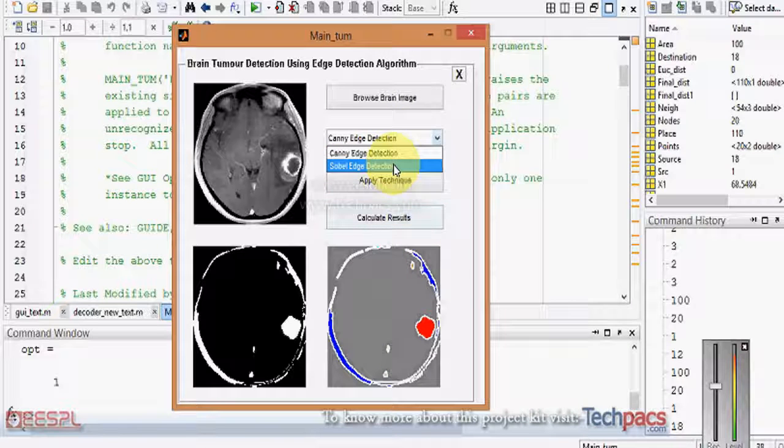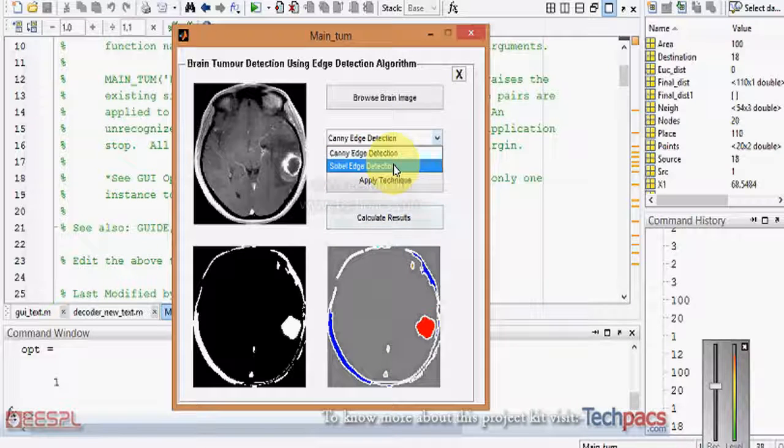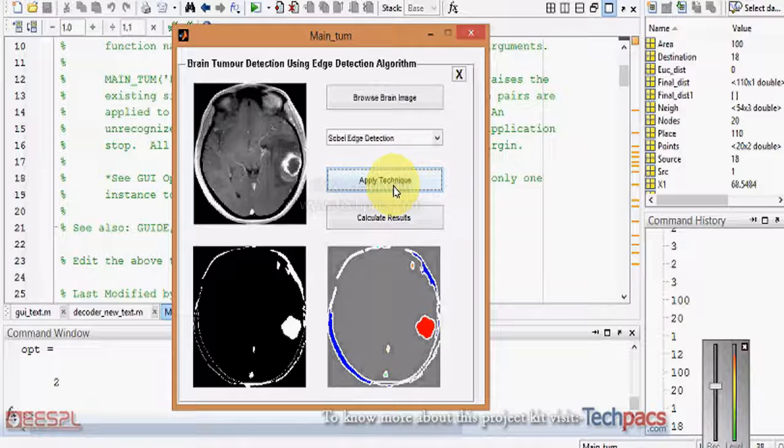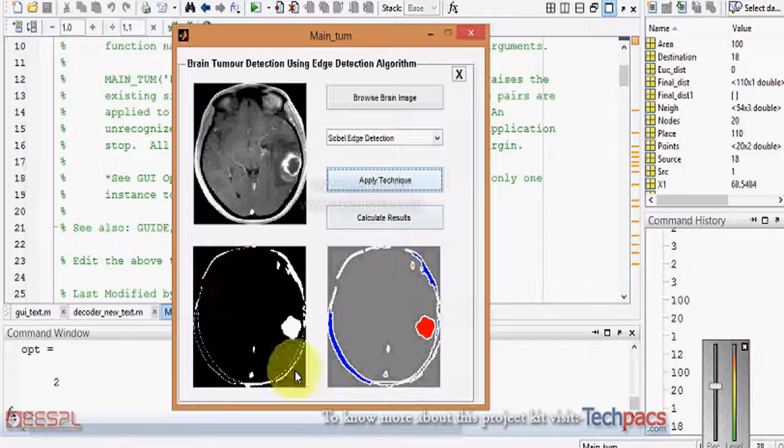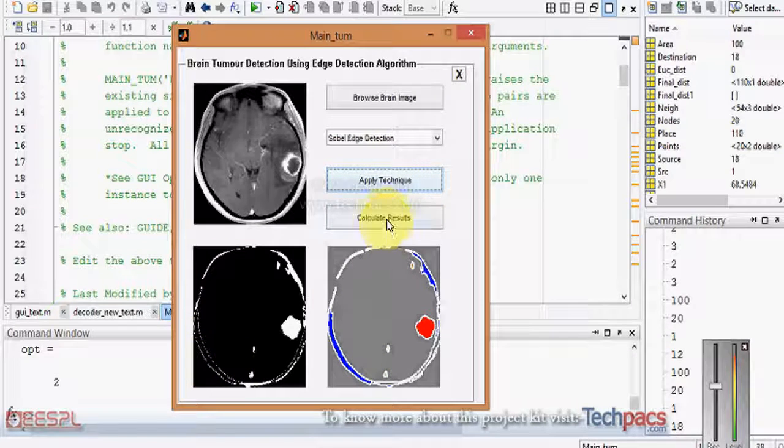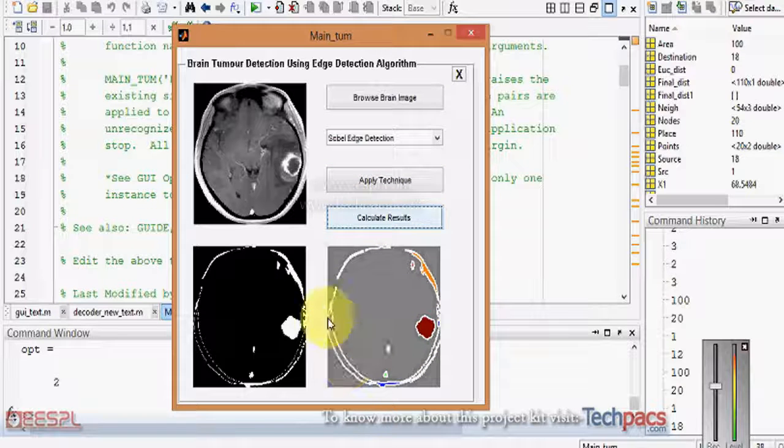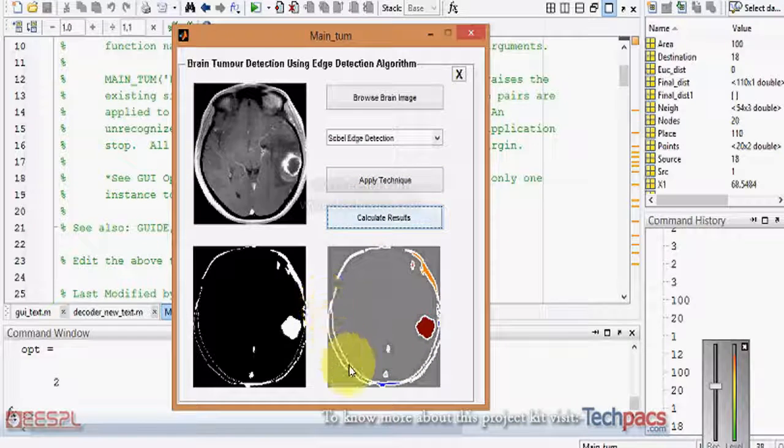Similarly, when I am selecting the another edge detection technique and apply the technique, it will give some of the different edges in the image. Later on when I click on this, you can see here the edges which were in the Canny detection - now those are not present in the Sobel detection technique.